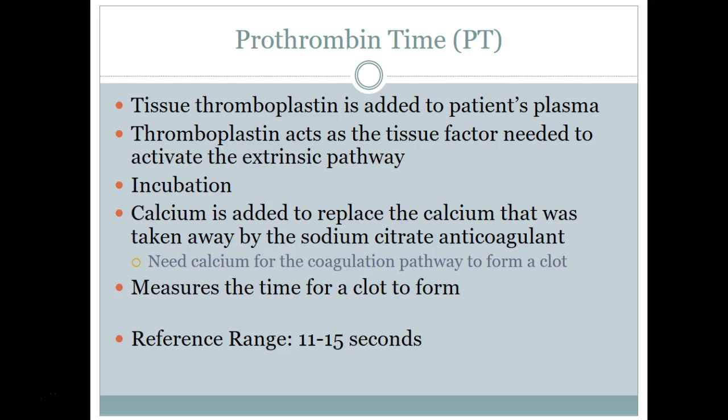We're not too worried about shortened times. I know I get that question a lot. In my world, I'm not going to worry as much about shortened times. Again, I teach more on a big picture scale here, just overall what happens. So I'm more worried about why it takes longer than 15 seconds for them to clot. That's typically what we're looking for, because that would indicate something isn't in place in them.